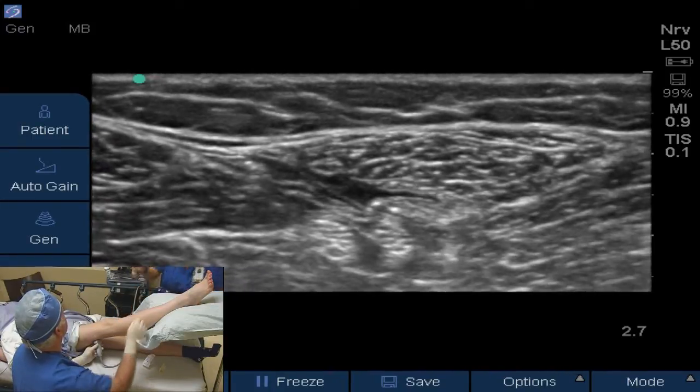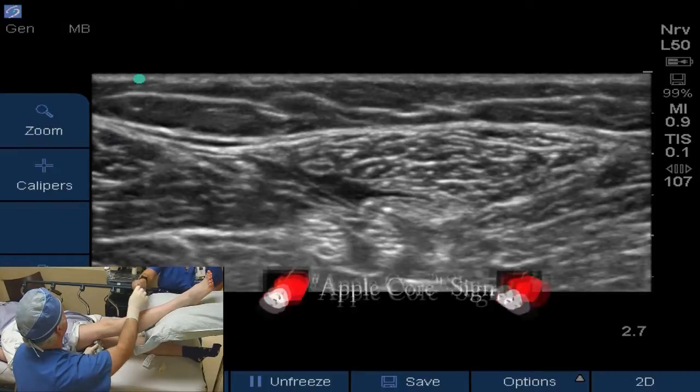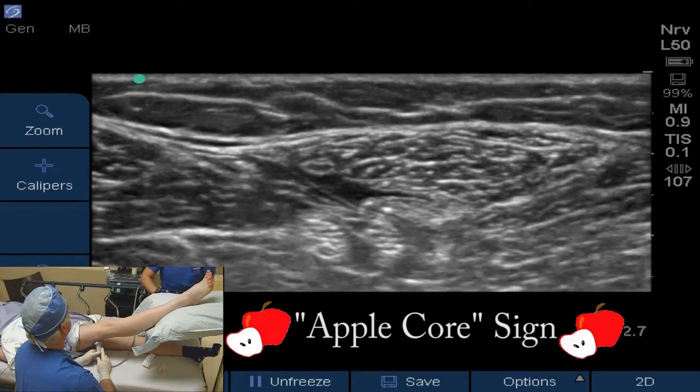We'll freeze that image right there and save that image to be placed on our chart. And that will conclude this popliteal block. She tolerated this procedure very well.